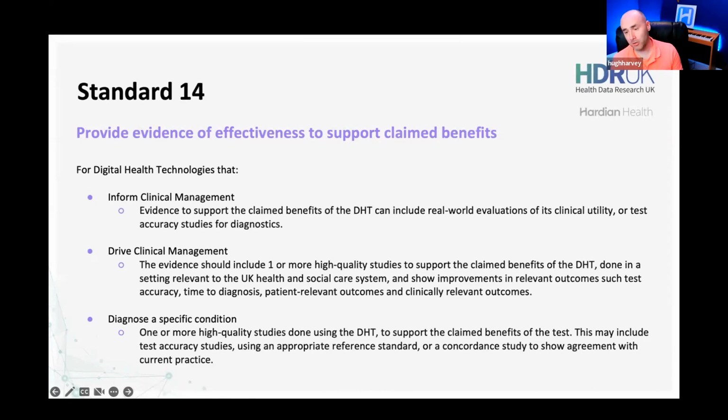And the evidence, as we've spoken to before, can be different. The evidence requirements can be different. So for informing clinical management, where you might be clinical decision support, where a clinician can look at the output of your device and choose to accept or ignore it, and might adjust their treatment plan or diagnostic decision-making process based on the output of your device, you need to show in real-world evaluations that you are actually able to provide clinical utility to a certain level of claimed accuracy. So you've done your studies to show what your benchmark accuracy is, and that you maintain that accuracy post-market.